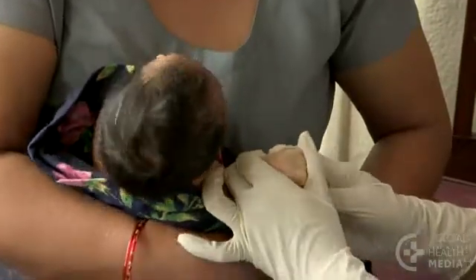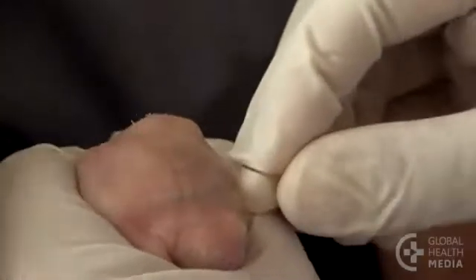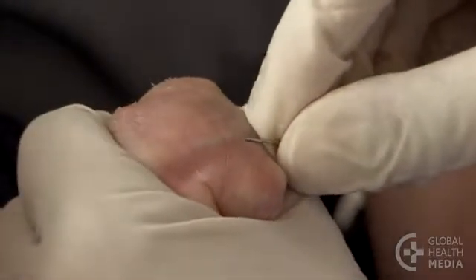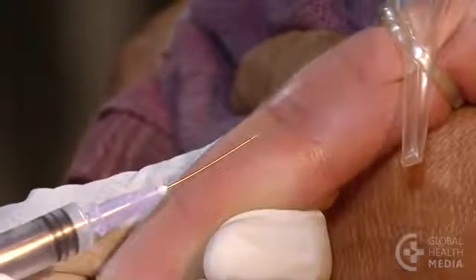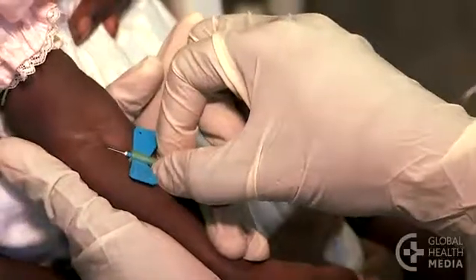This video will show you how to draw blood 3 different ways: with a needle, with a syringe and needle, and with a butterfly.